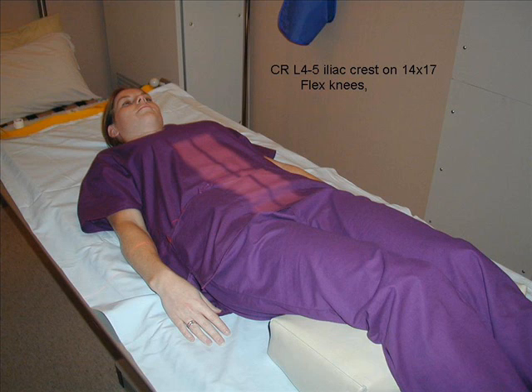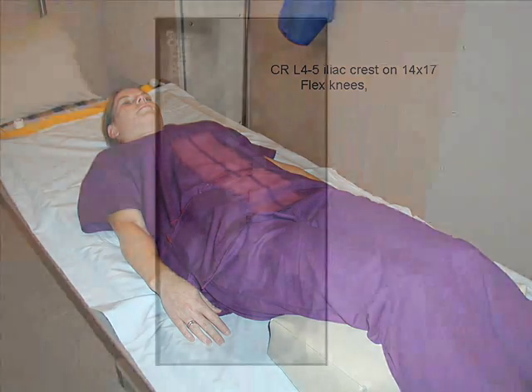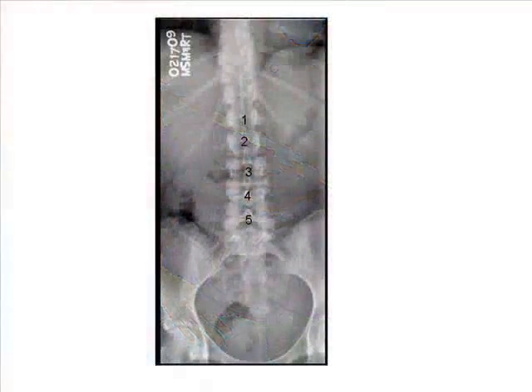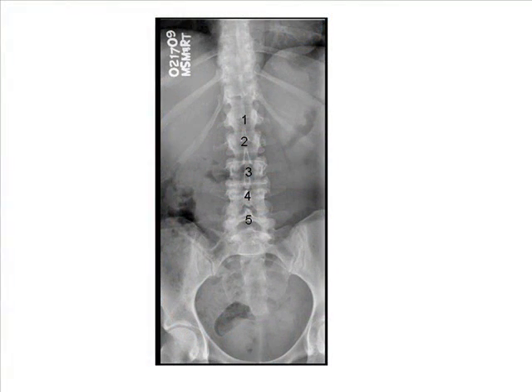Collimation improves radiographic contrast. Suspend respirations on expiration. Best demonstrated are the lumbar vertebral bodies, the SI joints, and sacrum.